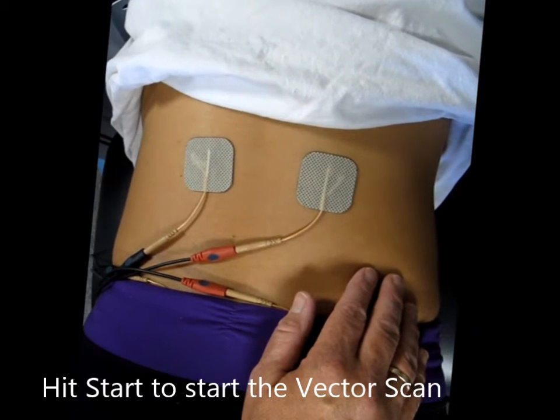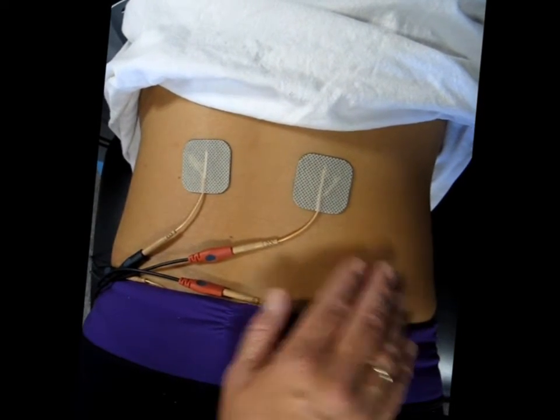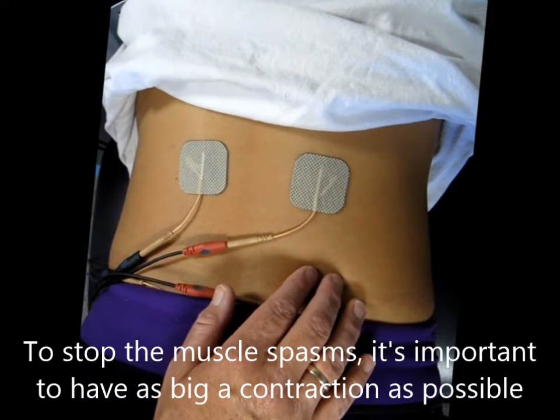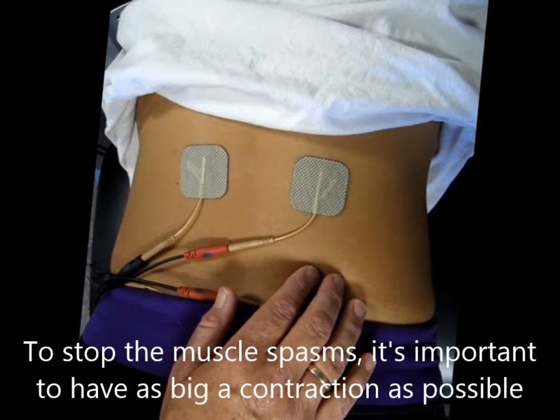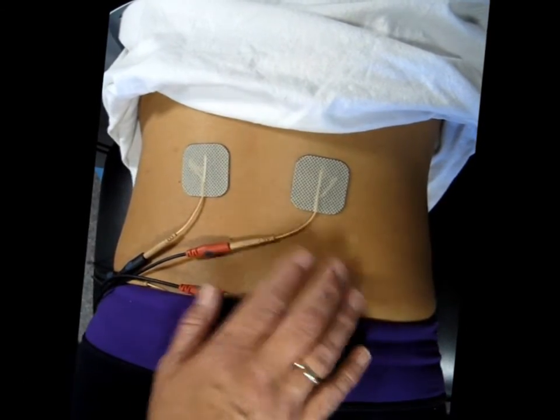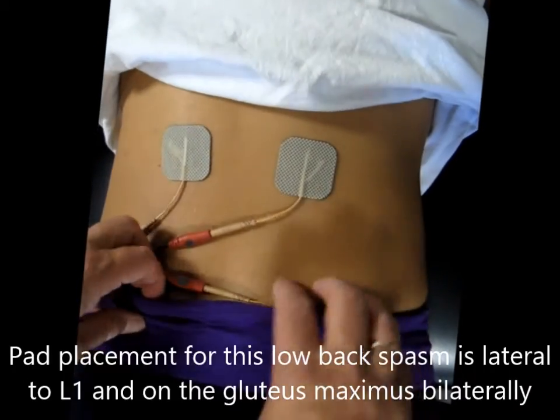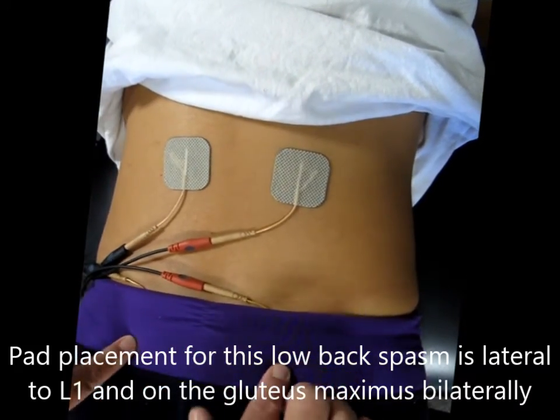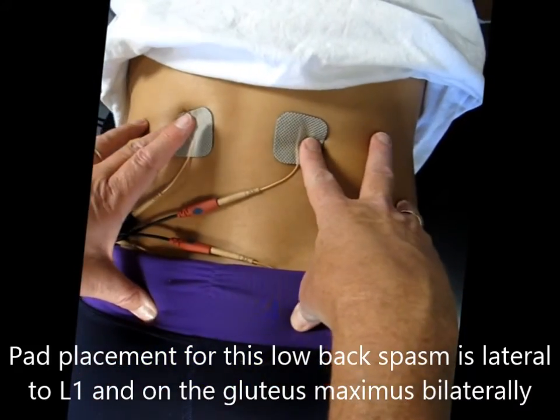Tell me absolute stop. That's good. You want your muscles to really be contracting. Can you feel it through there? Yes. Then we're going to go onto the vector scan again and hit start. It's very straightforward — you can go back and manipulate. Please note that I have located one of these pads right at the top of her gluteal region. That's a really good surround for this area.